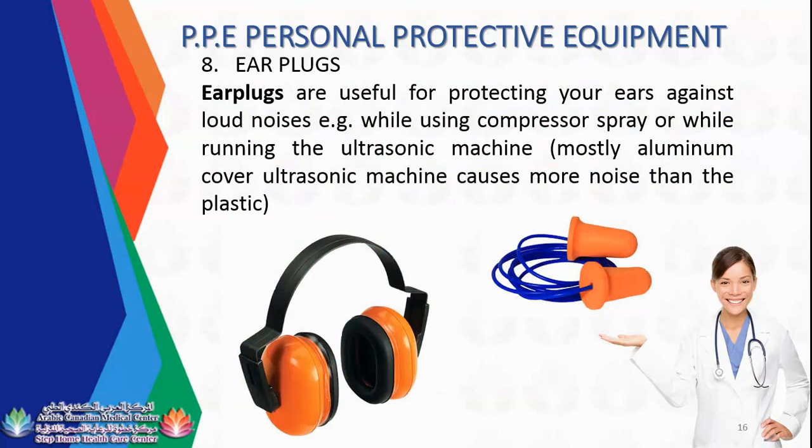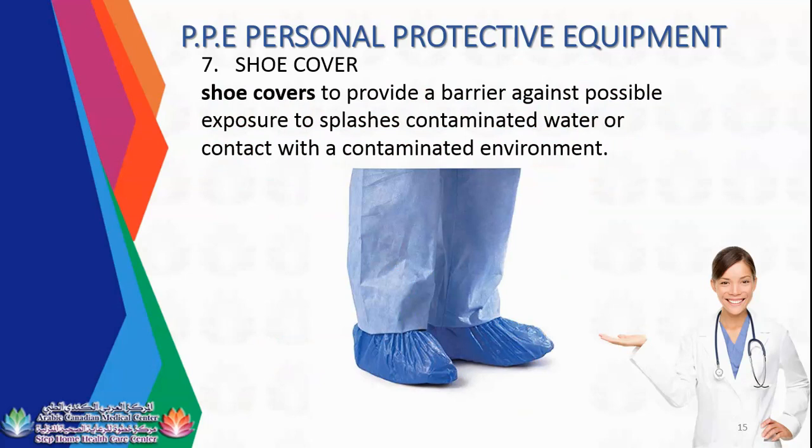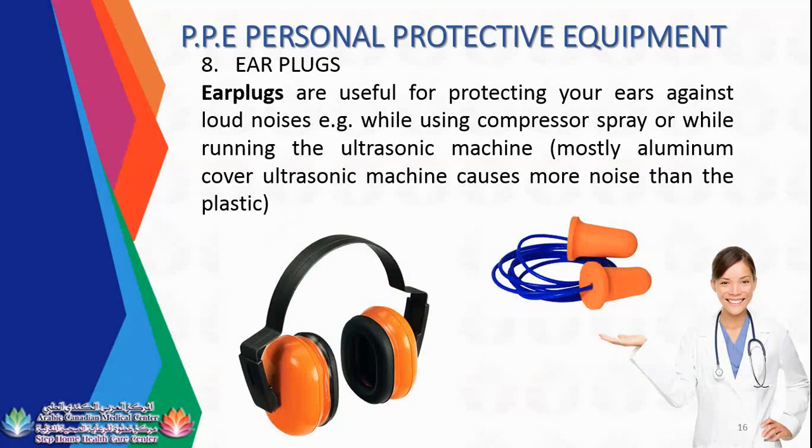Especially in your decontamination room, when you are not following the brushing protocols, which is to brush under the surface of the water, once you brush, you are contaminating the area, which means some aerosol will go on the floor and contaminate the environment. So you need to have the shoe cover. Earplugs are useful for protecting your ears against loud noises while using compressor spray. Actually, compressor spray is already eliminated, or while running the ultrasonic machine.